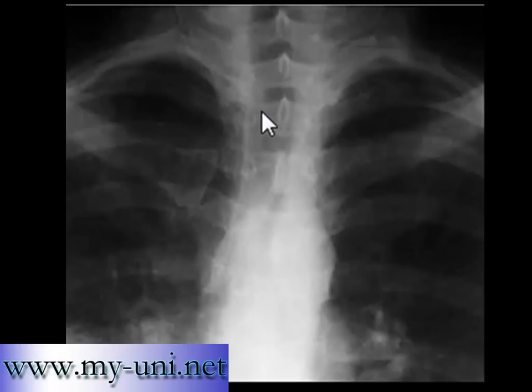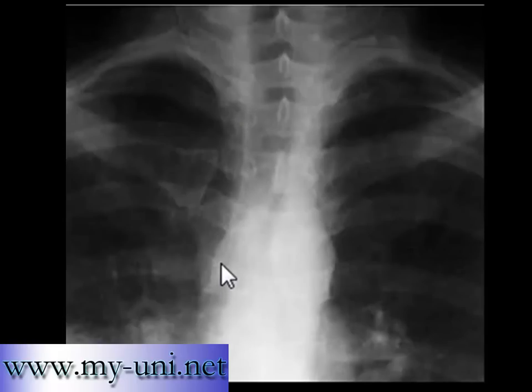On the right side of the trachea you can see a thin opaque line extending from the third thoracic vertebra level to the level of the azygos vein. This is the right paratracheal stripe, which is seen on around 95% of chest X-rays. It is a somewhat curved line of soft tissue opacity, a few centimeters long and between 3 to 4 millimeters wide.